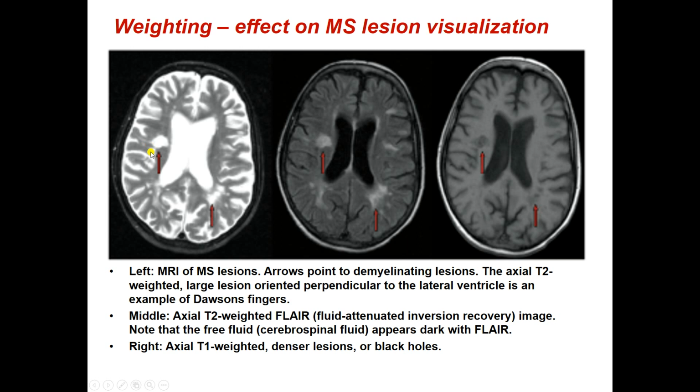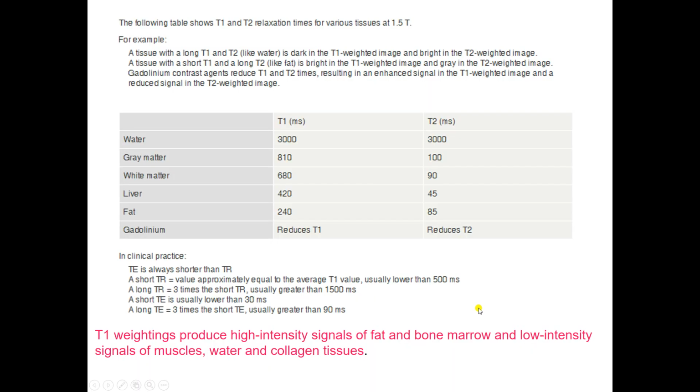All right, so this is a T2 weighted image. This lesion here, due to the MS, is quite bright. Here is another T2 weighted. This is a different type of T2. It's called FLAIR, so it's a little different. But here's a T1 weighted. So let's just look at the T2 weighting and the T1 weighted. And it's all about contrast. Would you say that you can see these lesions better here or here? Well, the point is you can run the experiment and set the contrast where you want it to really visualize what you're doing. That's something you cannot do with CT.